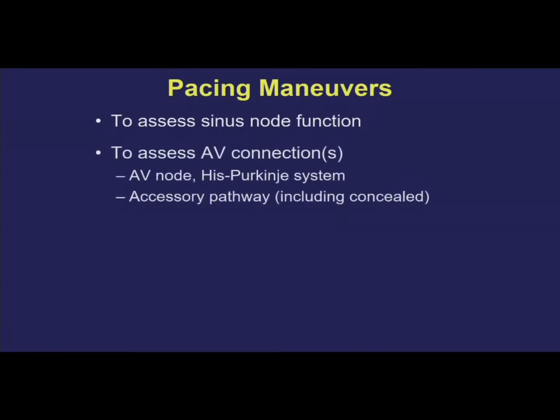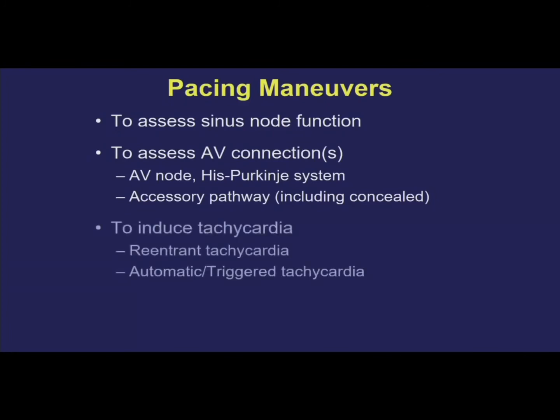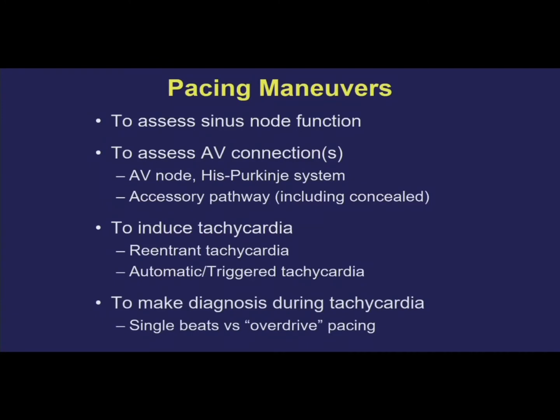So, pacing maneuvers that we do, and Sam talked about this, so I'll go through this slide pretty quickly. We will do pacing maneuvers during sinus rhythm to assess the conduction system, including sinus node and AV connections, and to try to induce arrhythmias. And then during tachycardia, we do it to try to figure out what is the mechanism and location of the tachycardia.